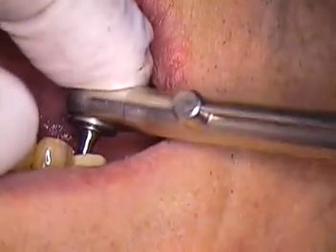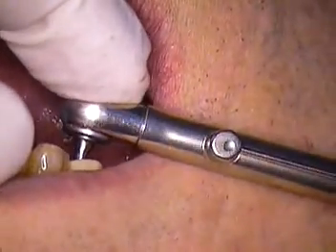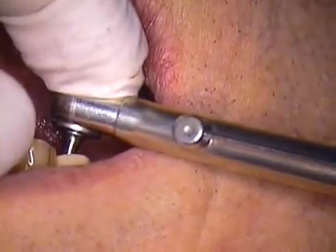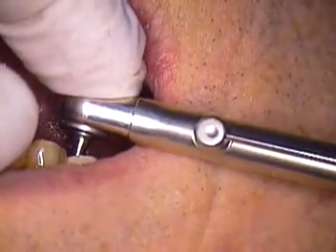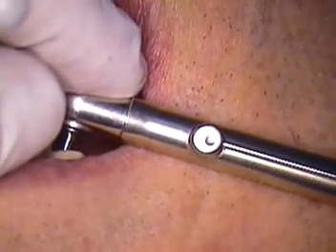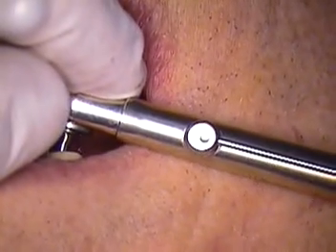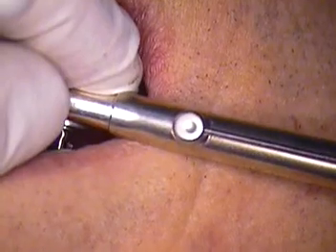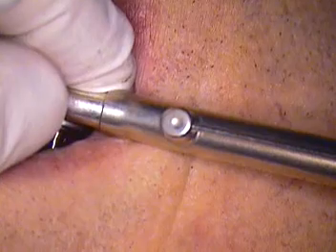Let's find our little drop in here — it's a star wrench. Let's torque it down. Does that bother you at all? There's 35, right about there.